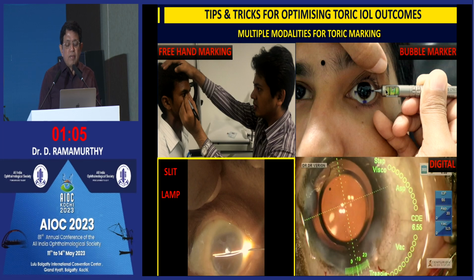Otherwise, for a long time, we have been using this bubble marker, where it has to be absolutely parallel to the floor, and this bubble has to be in between these two lines. You get a mark on the 0, 180 and 90 degrees axis.